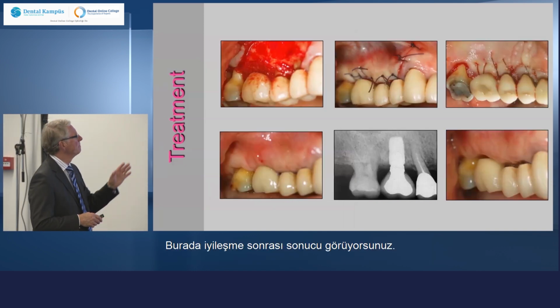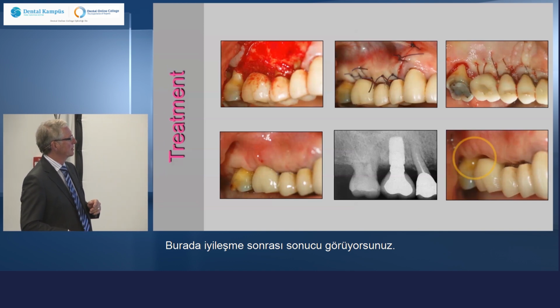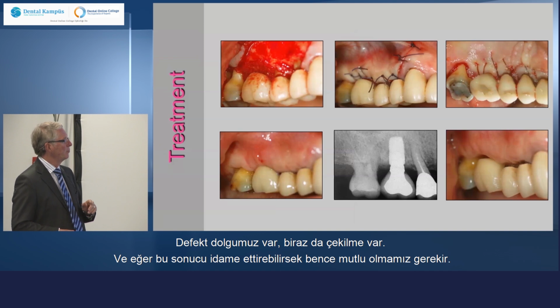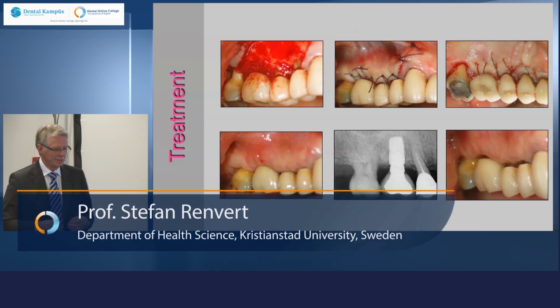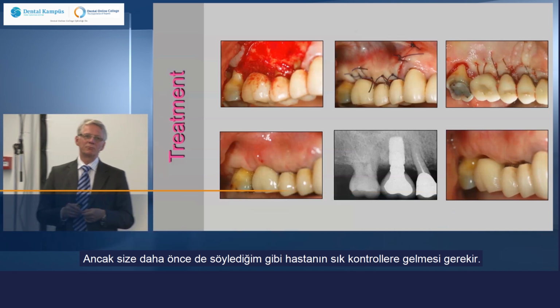And here you can now see the results. These are the results following healing. And we have some defect fill, and we have some recession. And if we can keep this result, I think we have to be quite happy. But as I told you before, the patient needs to come on frequent recalls.